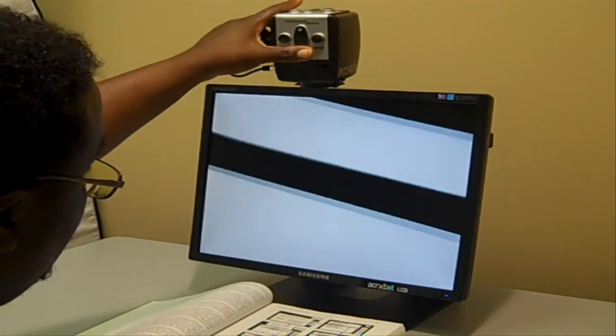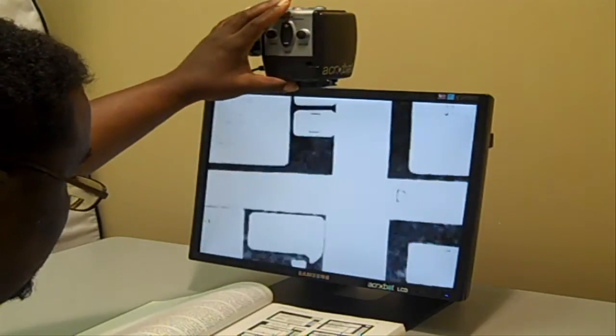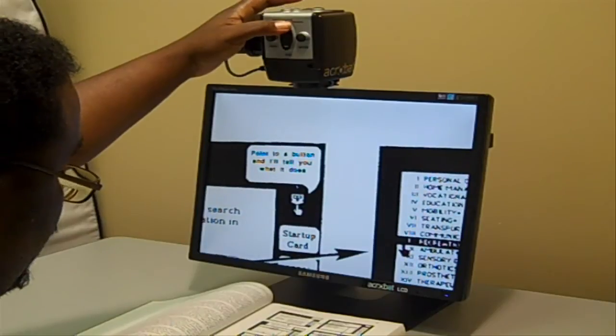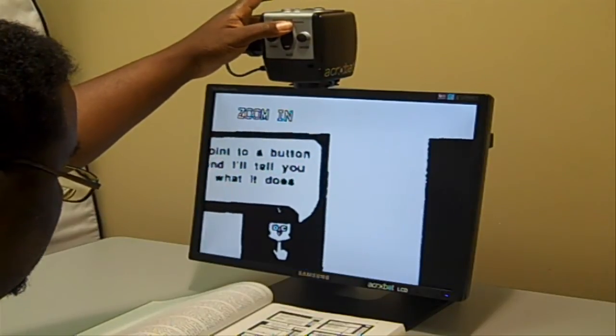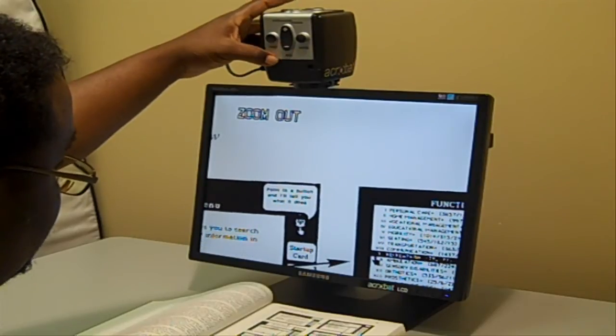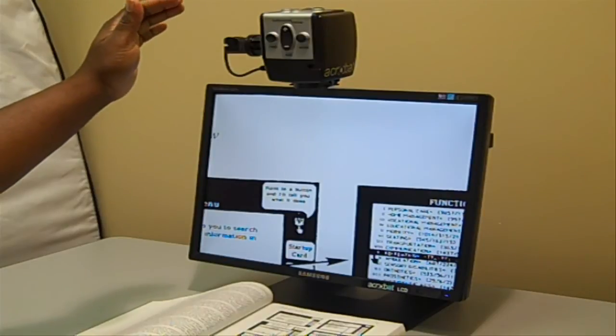You also have these wonderful magnification controls. On top of the lens screen you can zoom in and zoom out, and you have the mode button on the other side as well to change the different color screens.